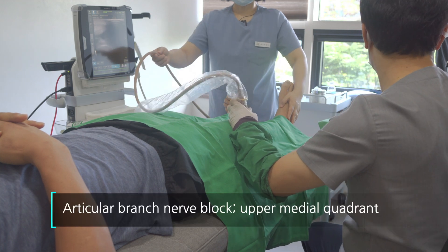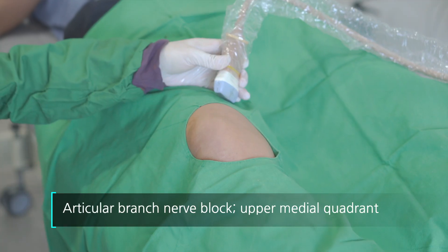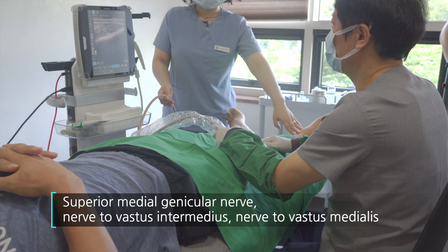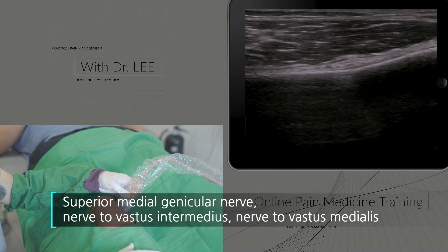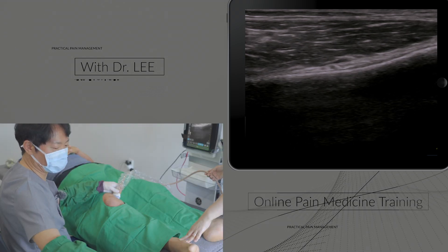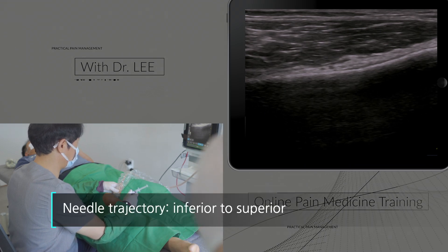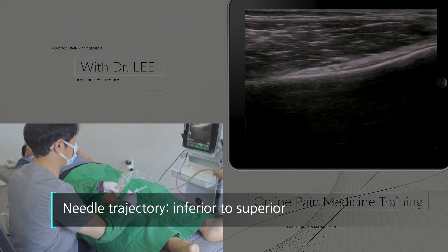This approach is the upper medial quadrant articular branch nerve block. In this technique, I aim to block the superior medial genicular nerve, nerve to vastus intermedius, and nerve to vastus medialis. I put the needle at the middle aspect of the knee and approach the needle from inferior to superior.